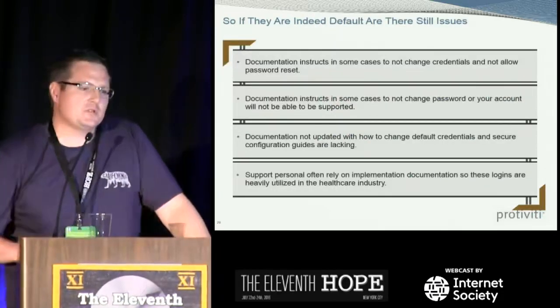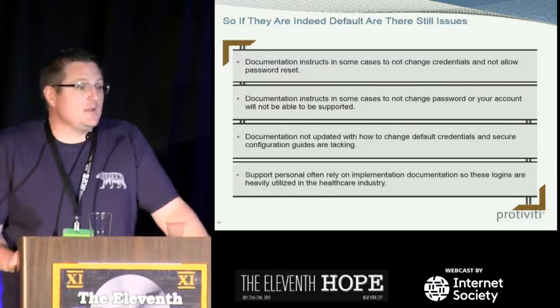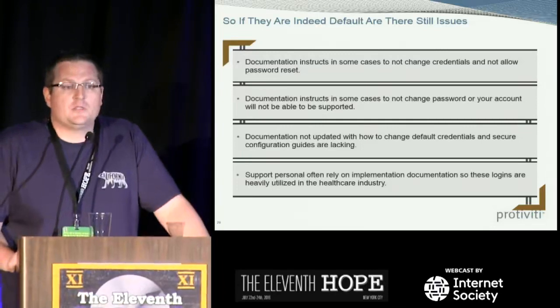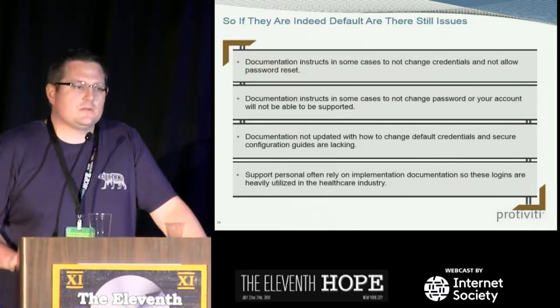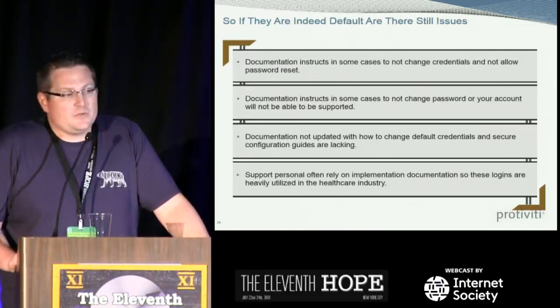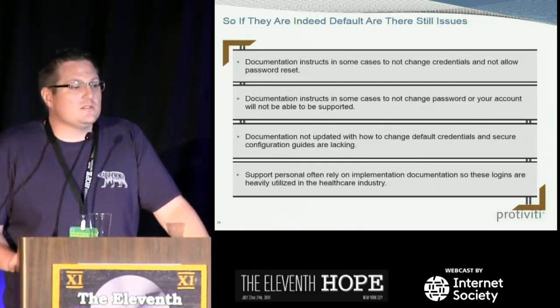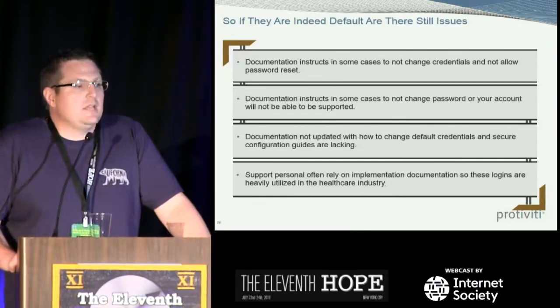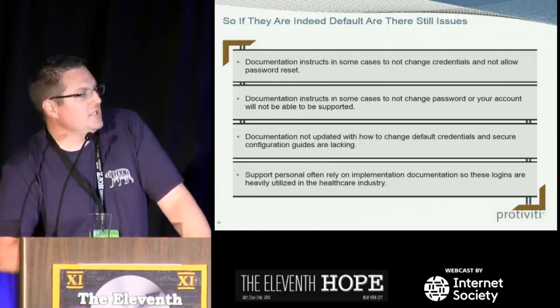So when we went through disclosure, some of the responses were, hey, a lot of these are default. In some cases they are default, and in some cases they do actually provide instructions in the manuals given to the installers or to the hospital systems that, hey, you should change this and this is how you should do it. But saying they're all default is contradictory, because I will show you some examples inside of that specific documentation that would indicate otherwise. These are the installation guidance that either the manufacturer support staff or the hospital or a third party are using to install. So there are still indeed issues.